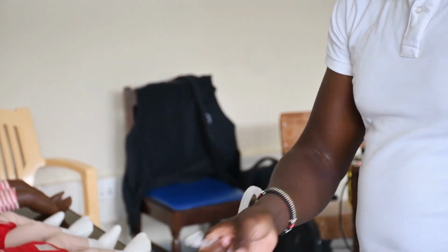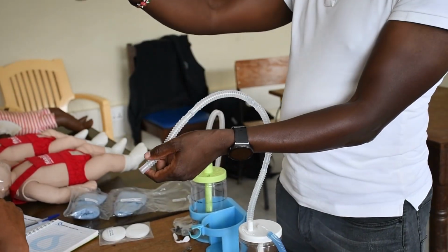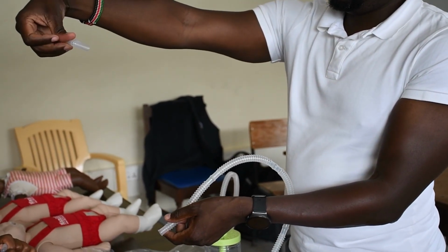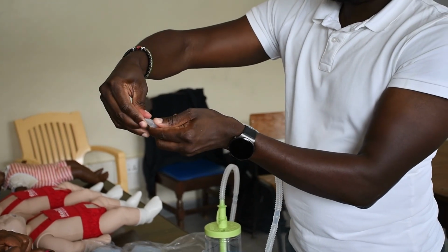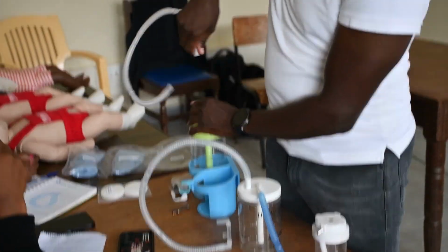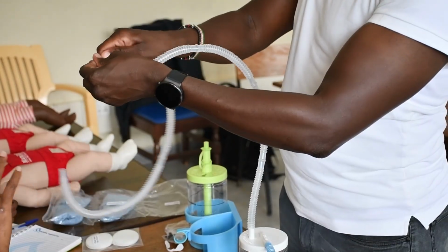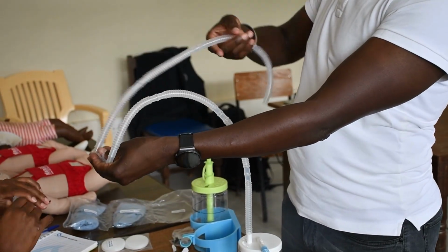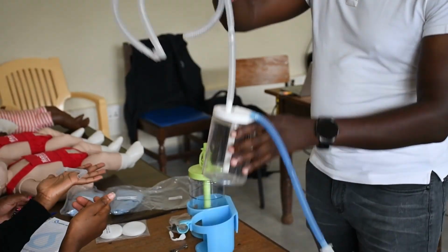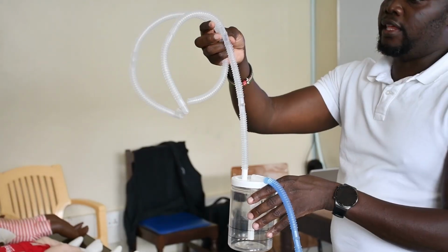Okay? So you determine how your patient will be positioned, and then that's what makes you determine how this is going to come in. So if my patient is somewhere here, with the head facing this side, then my prongs will be this way. Okay? So that comes to the first end, and then you need the second tubing for the inspiratory. That's the second end of the tube. Okay. So getting to this point, you have your baby already getting there. Inspiratory needs, and then they'll expire.